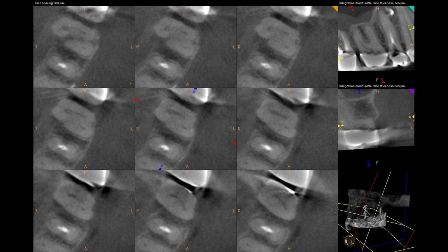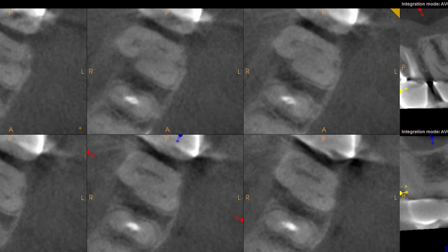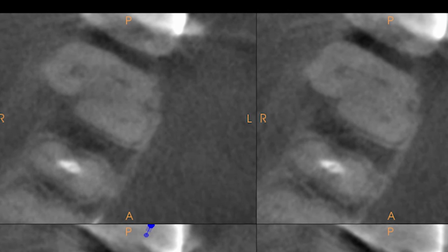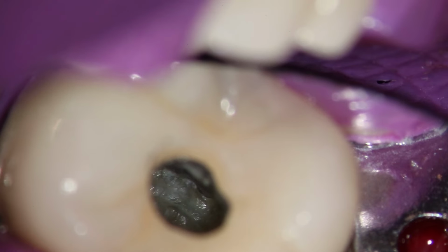So now I have to use that road map to find the palatal canal, which is easy to do. When you look at the CT, you can see that they are connected more coronally. So I know if I trough along that axis, I'll actually get into the palatal canal. And that's exactly what I do. And using the ultrasonic, I just trough along that axis, and I'm able to find it.